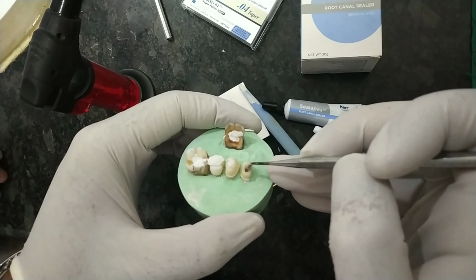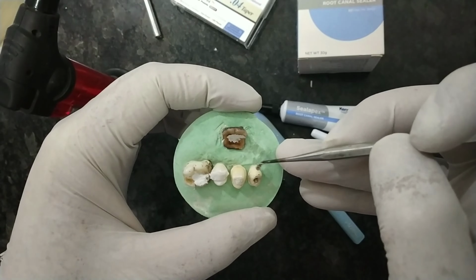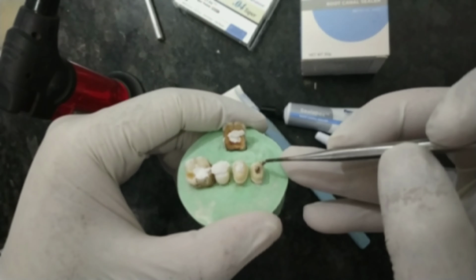Now you have to fill this with either composite or glass ionomer cement, and you have to send the patient after that. Then you have to send the patient for crown cutting or whatever procedure or whatever process you want to place. So that's all with today's video.